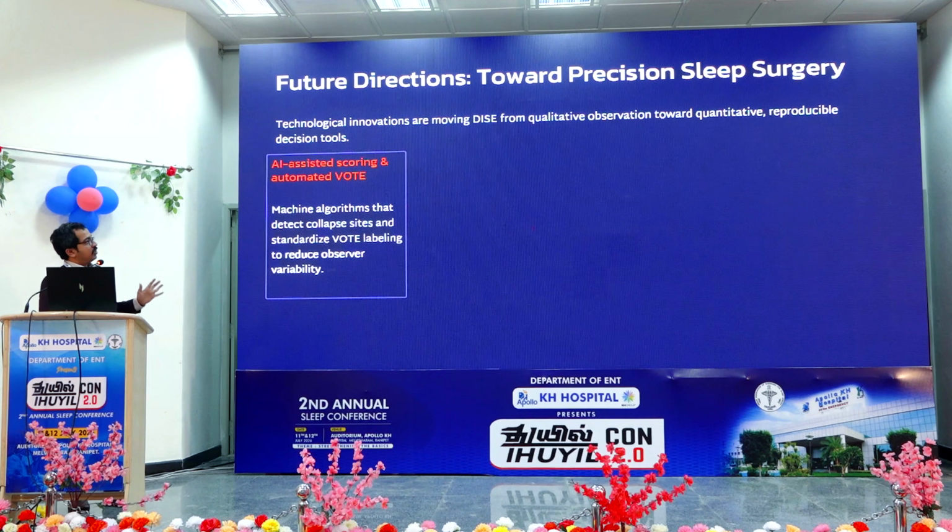And there are the newer technologies like AI induced scoring or automated VOTE. AI is not going to replace a sleep surgeon, but this is where sleep surgery is going to change. Like I said, right now there can be subjective variations, but AI is going to score the DISE findings, and it's going to be objective based on how much percentage of the airway is collapsing, at what levels, and what type of collapse is happening. So it will become an objective scoring system.